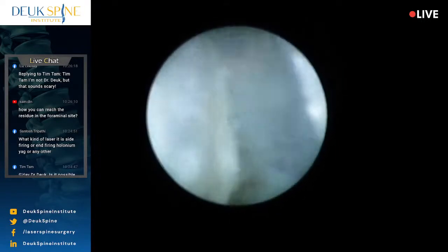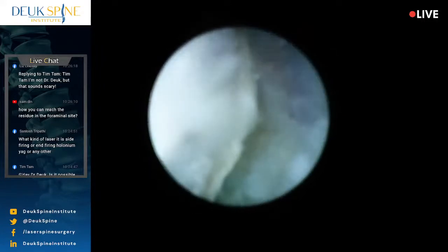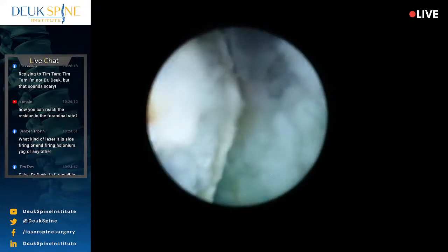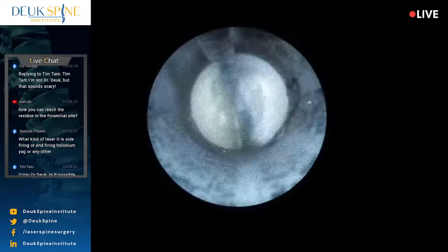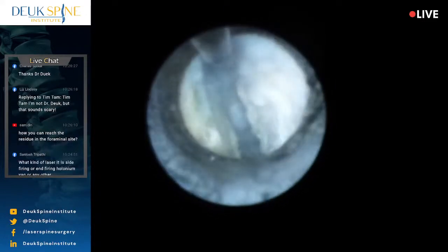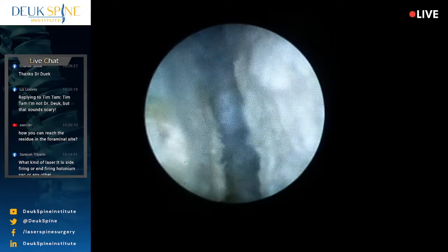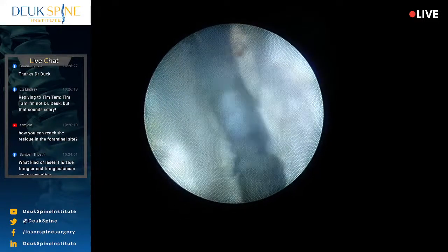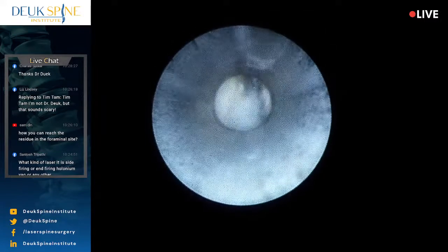All right, so we are in the foramen on the patient's left at C3-4. There were bone spurs here. You can see the fibers of the posterior ligament down there. There's a little bit of red around them, just some blood vessels like veins. We are out in the foramen, and I'm trying to get that herniation out of there. There's a little bit left. I've gotten most of it. You can see the dura down there. And I don't see anything left in the foramen. I think we've gotten it all. Pretty good view there, huh?